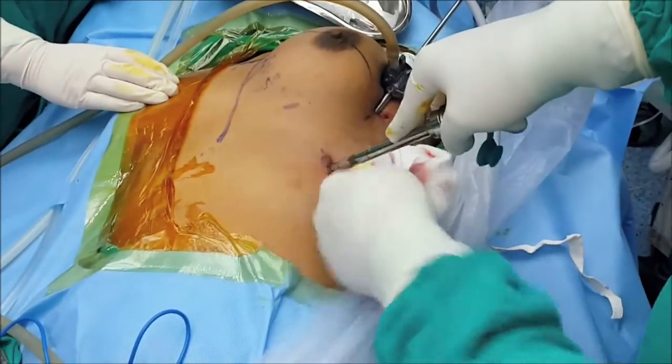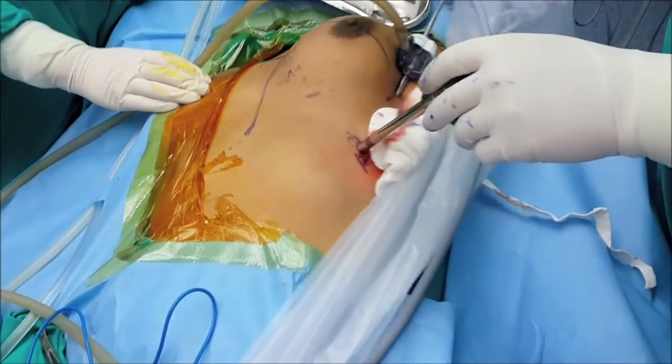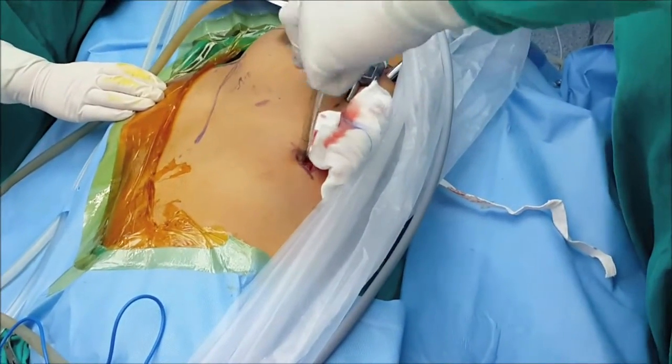You must guard your port very well because you are putting it in the chest — and remember, on the left side the pericardium is right beneath it. We are now using a 5mm short-tail port here.